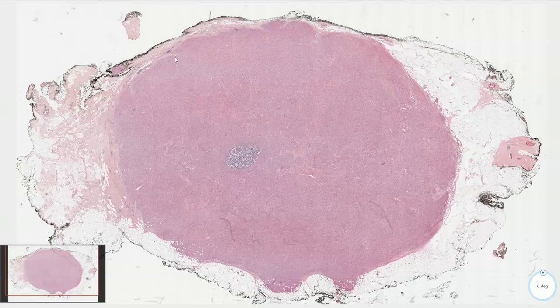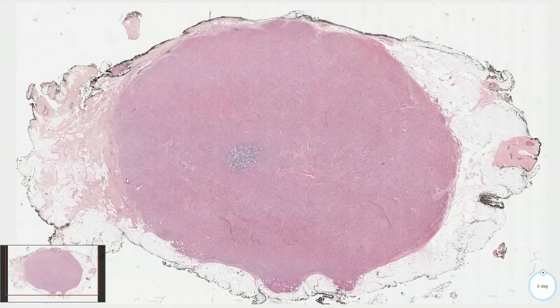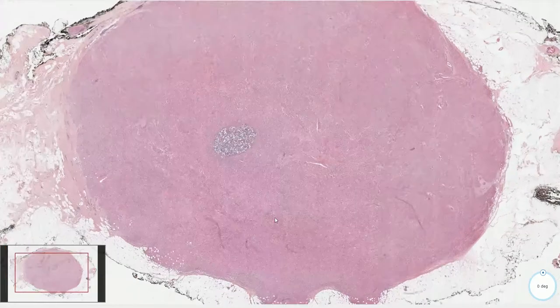This is a breast biopsy with a relatively well-circumscribed lesion with some fibrous capsule on the periphery, but in these parts it is also associated with an infiltrative type of growth.